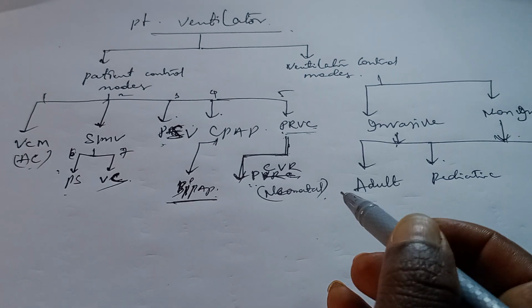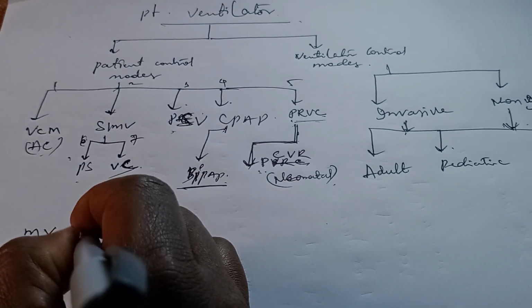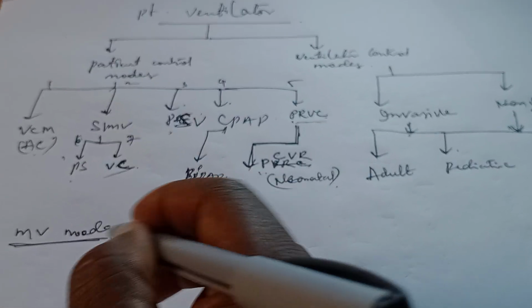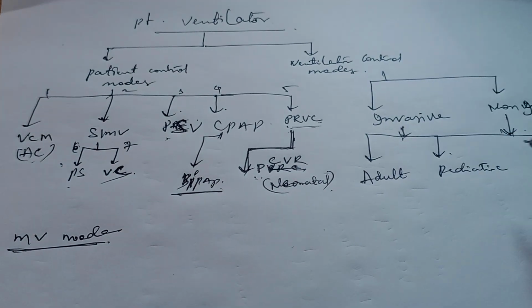And manual mode also is there presently, but it's not mandatory. There is an MV mode. This is manual ventilation mode. Nowadays nobody is using this, because all automatic modes are active in all the ventilators.